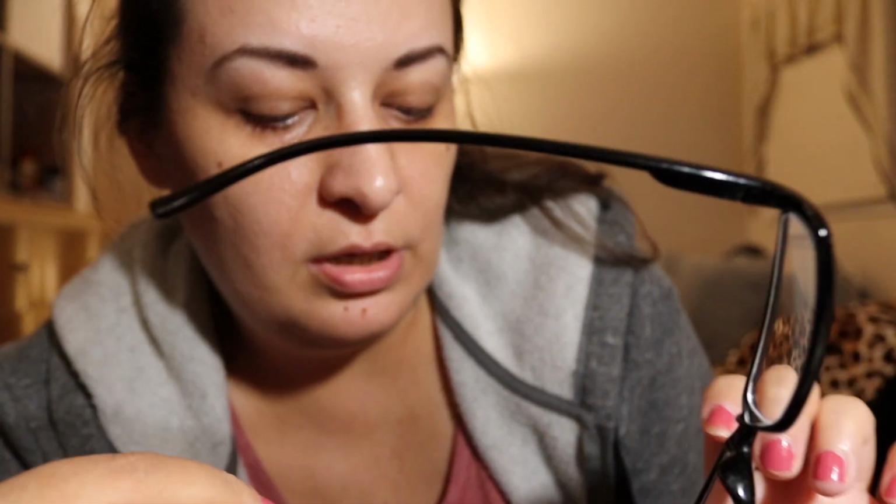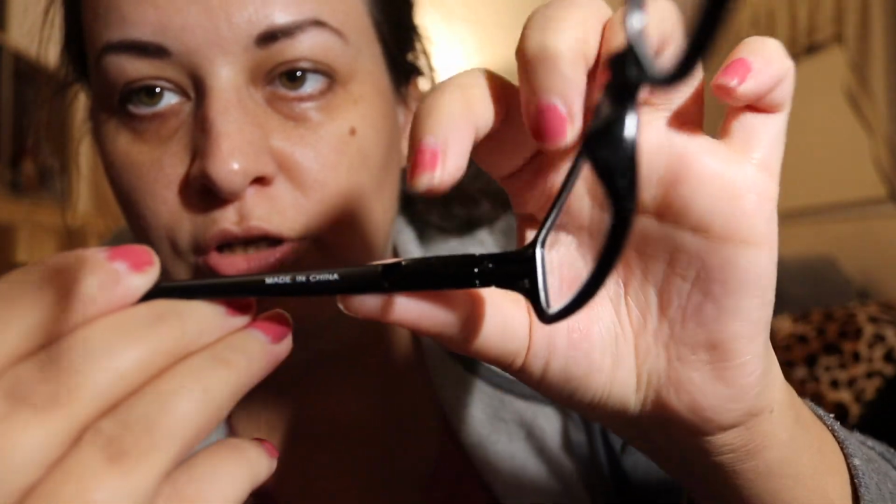I don't have a hinge here, but this pair has something here, some mechanism that allows it to spread a little bit on the sides. See? So it's good because if you have a wider head, you can still wear them. And some cheap glasses from the dollar store, for example, don't have it. That's why many glasses that I buy, sunglasses in some cheap stores, are tight here. So these ones are good because they don't feel tight.